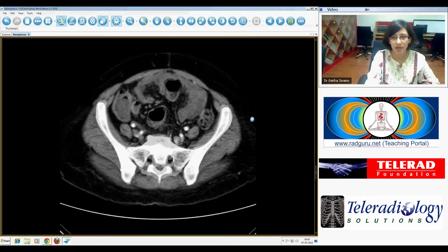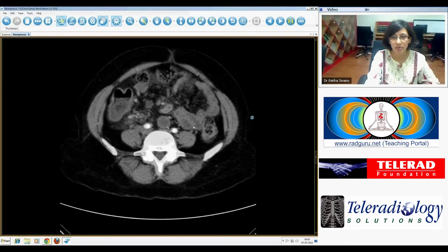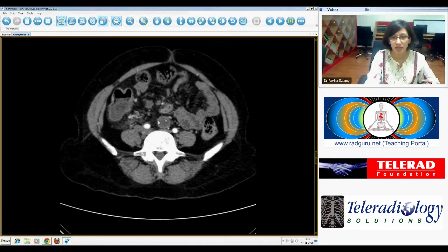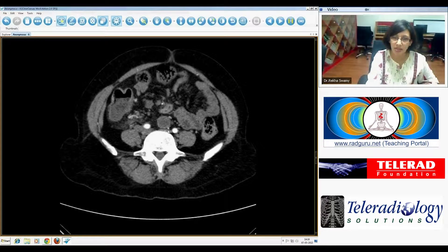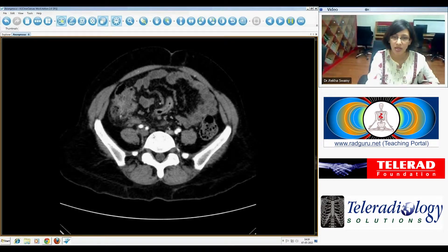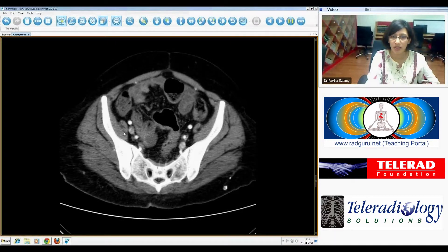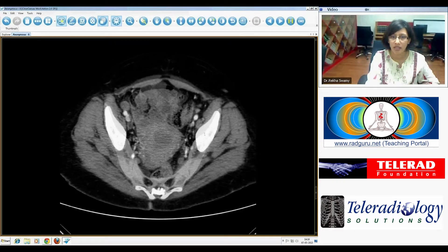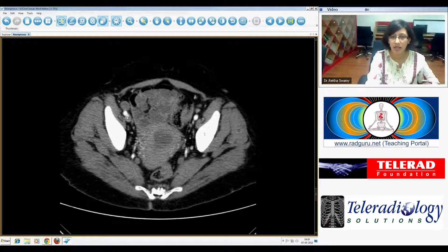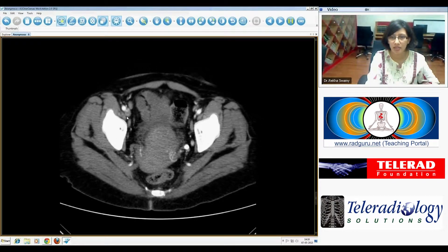Apart from that, we see further necrotic nodes — there's one just beneath the bifurcation of the aorta, and further down as we go along the external iliac vessels as well.